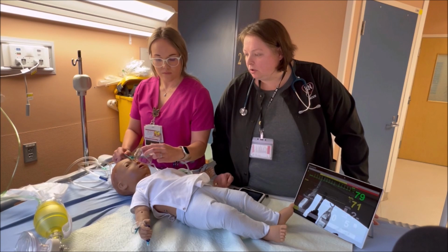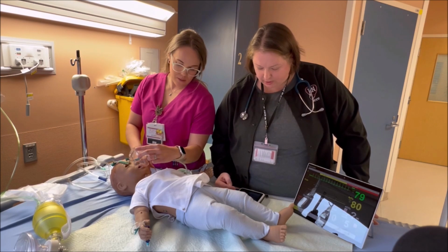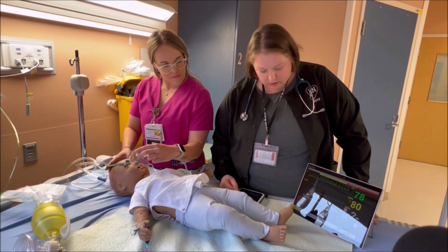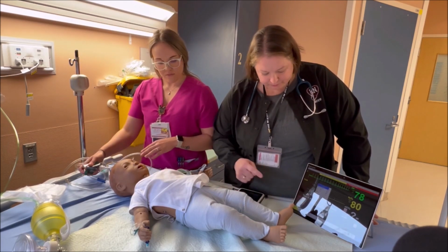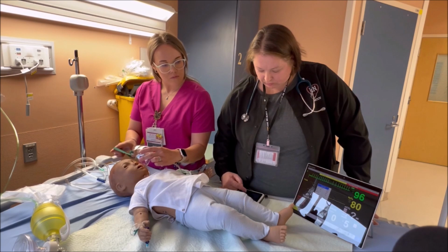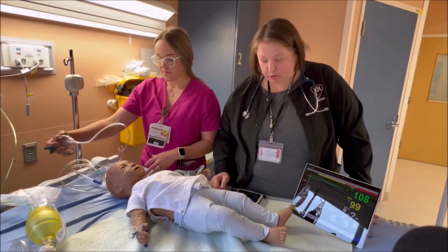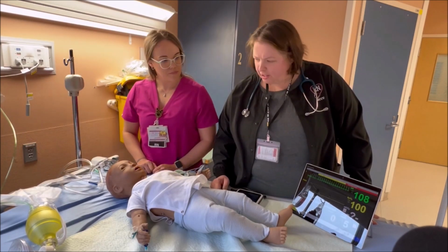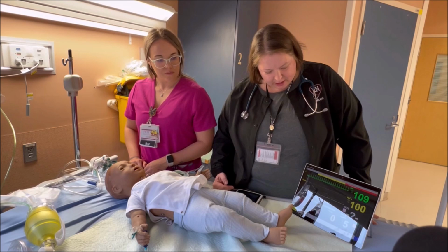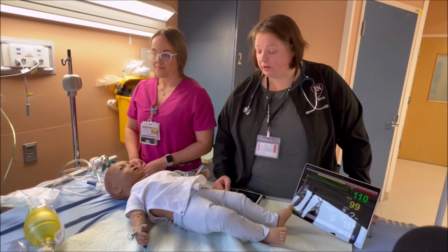All right. Looks like the seizing has stopped actually. Oxygen level is going up, so that's good. Color's improving. We should probably check a blood pressure too. O2 sats continue to go up. Good job. Oxygen level's gone up quite nicely, so we can probably even take it off, do you think? I think so. Does he need any more suctioning? I think he's doing okay. Looks good. And his breathing is getting back to normal too. His respiratory rate's starting to go up there, I see. I'm going to check another blood pressure now that we've given a bit more fluid.